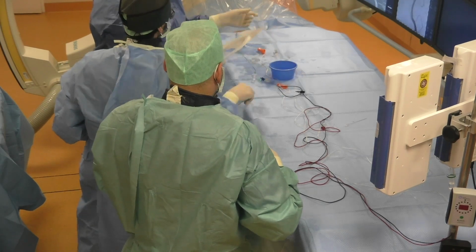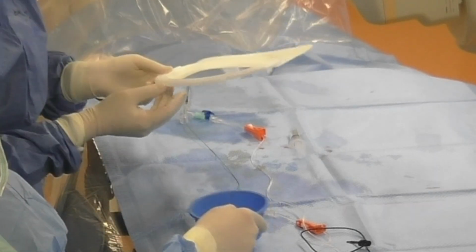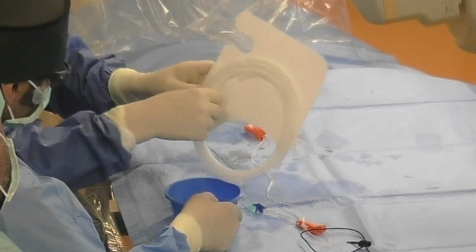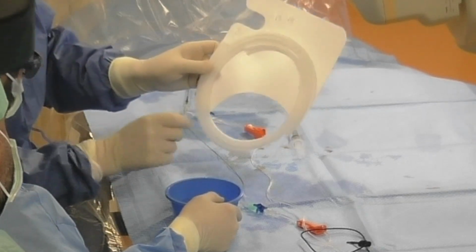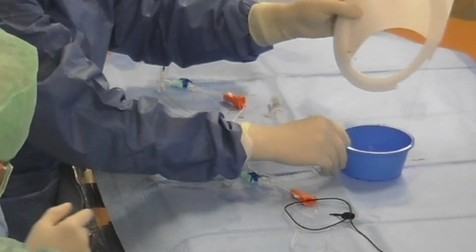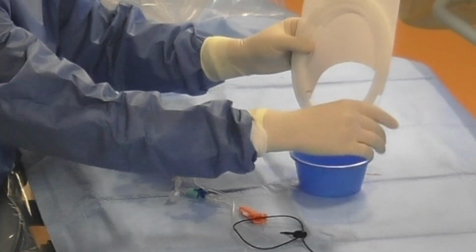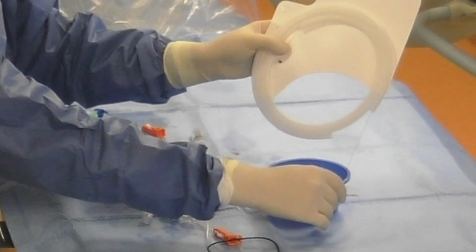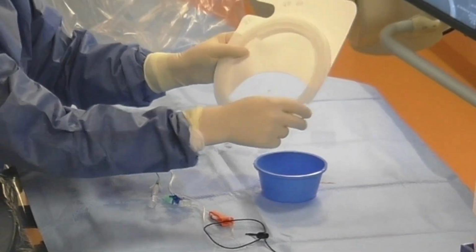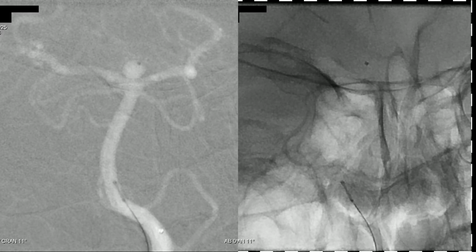And now we can take our contour device, flush it in the water, in saline. We push it a little bit forward. It appears, and now we can put it in the water. And now we can take it back. Another time in water so you can see how we do it. And now we pull the contour device back. And now we can take it and flush the whole system in the hub of the microcatheter and push the contour device inside the microcatheter.